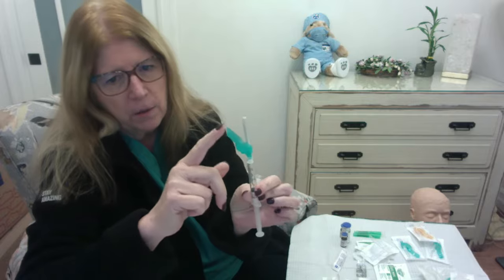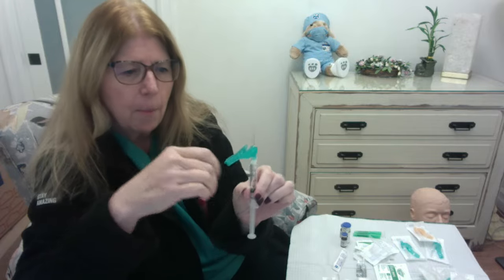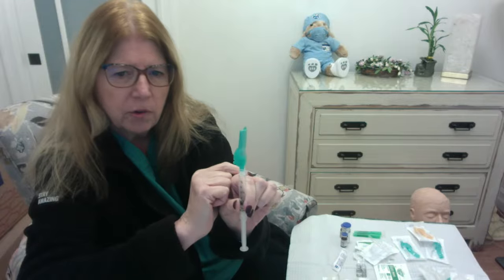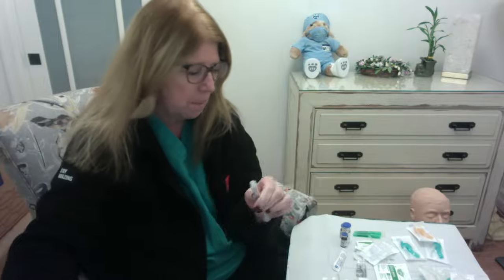This particular needle that I have here has a safety device on it. So if I were to take the cap off, and after I've used this needle, I would simply flip this up until it clicks into place, and now it is a safety needle, and I cannot use this needle anymore.